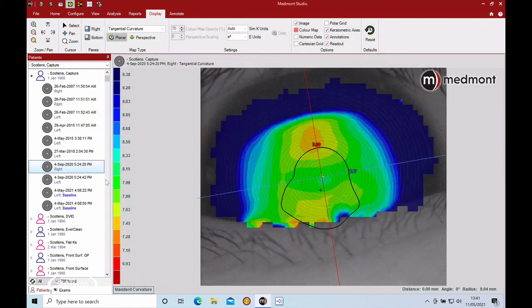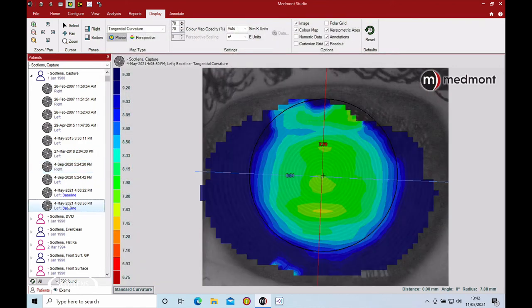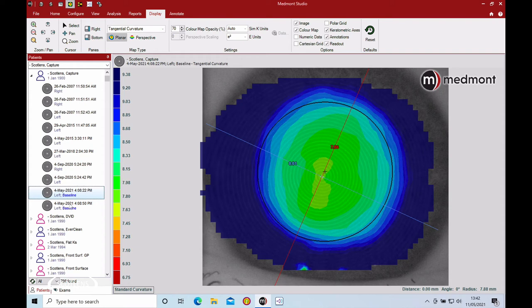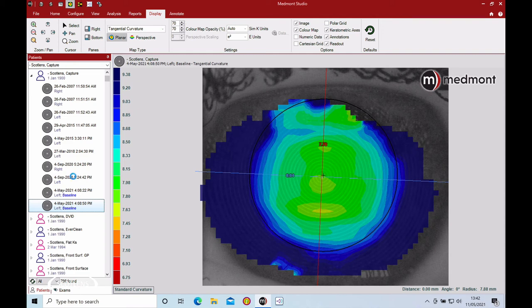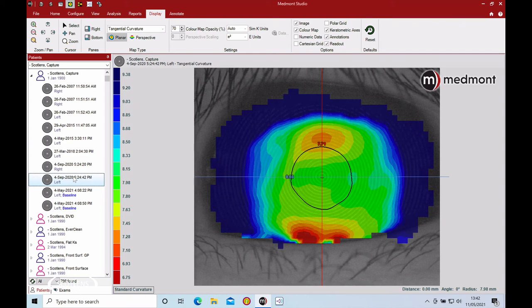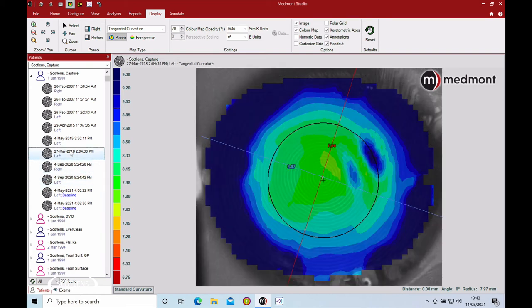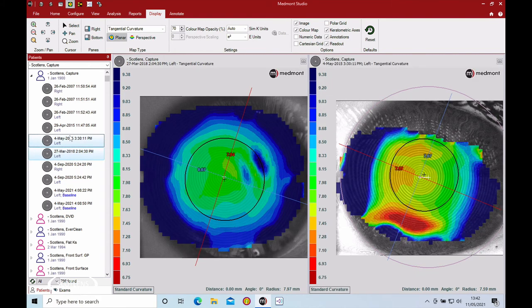Let's take the color map on and have a look at these two. The top one has got a nice full capture, and you can see this image is cut off at the top a little bit. This image, the lower lid is in the way, and this is not keratoconus, this is just tear film meniscus that's been dragged up slightly.